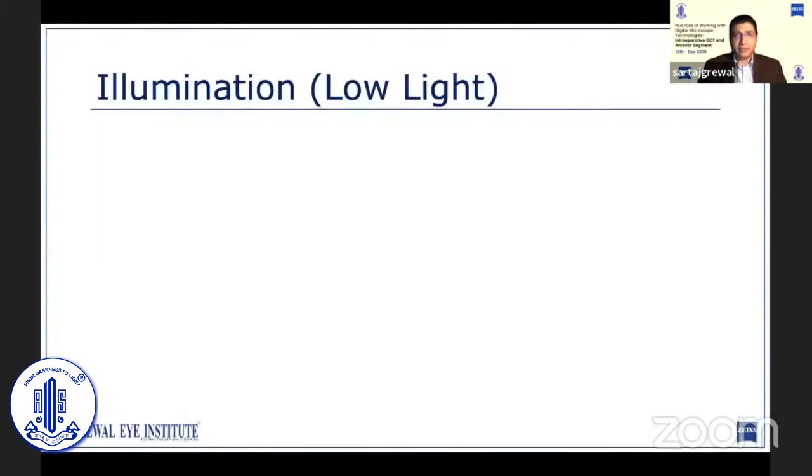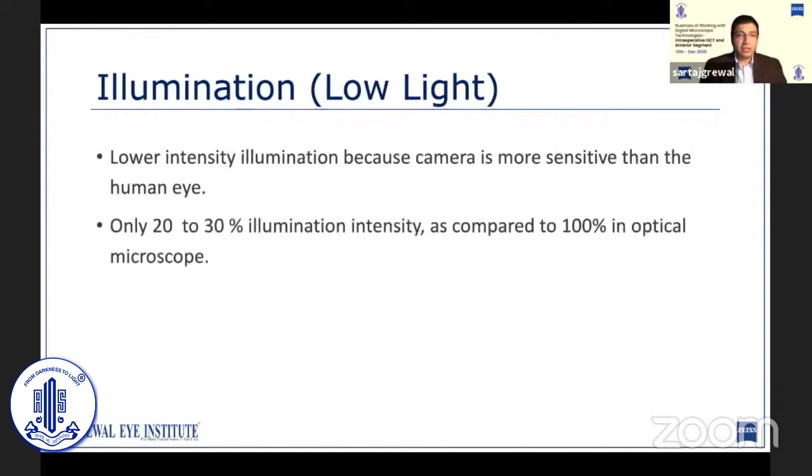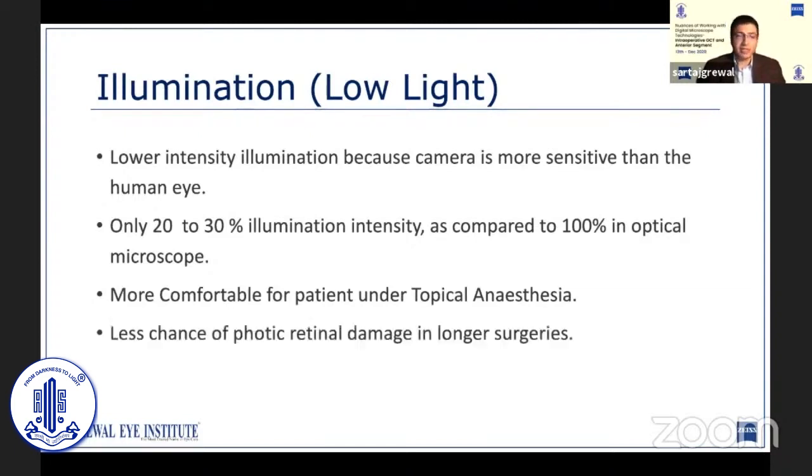One of the significant advantages of moving to digital optics is that the camera allows us to operate on much lower illumination. You can comfortably operate on only 20 to 30% of the illumination intensity, as compared to almost 100% on a conventional microscope. This can reduce the chances of phototoxic damage to patients and makes it more comfortable for patients who are under topical anesthesia.